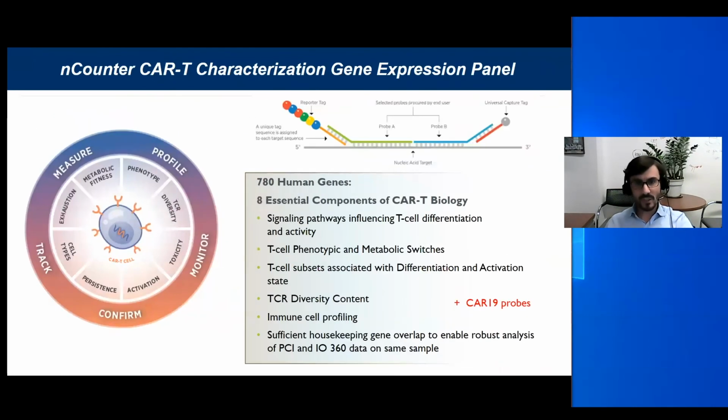So we hypothesized that we can capture these signatures and this characteristic of the T cell by using a more targeted panel and using the NanoString technology that is shown here and has been described, where you're able to capture the gene expression of a defined list of genes with a very high efficiency, and it's quite straightforward to acquire and to analyze the data.